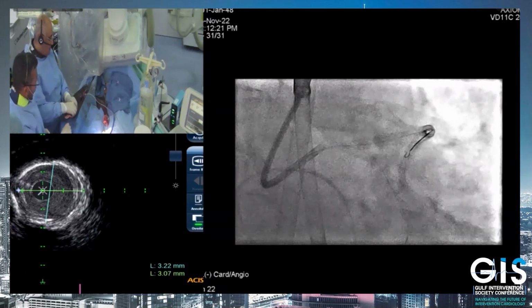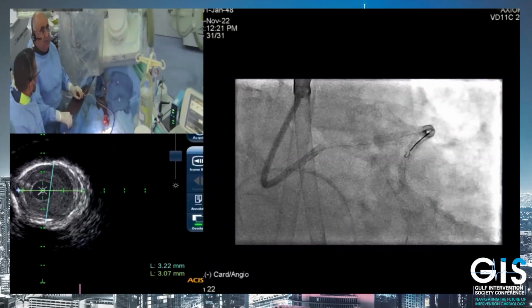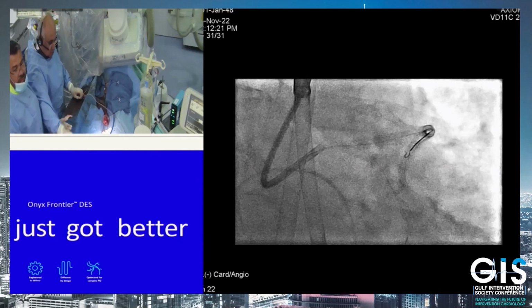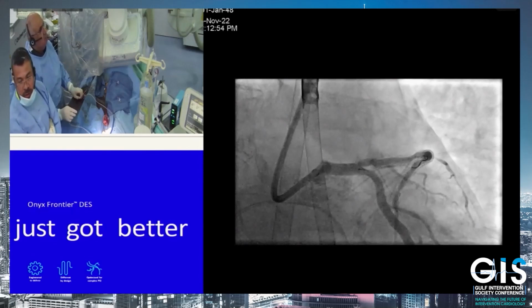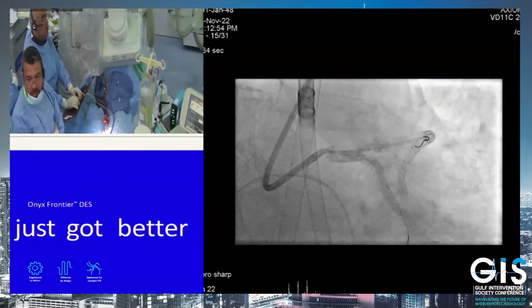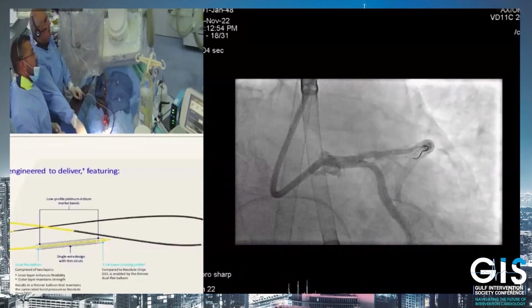For the circumflex, we have atherosclerosis around 30%. Because as you said, we are using the strategy now. I would use IVUS once again to evaluate for achieving a good plaque debulking in terms of creating cracks inside the lesion, and then pushing IVUS just a little bit further to evaluate also the in-stent segment. PA cranial, please.